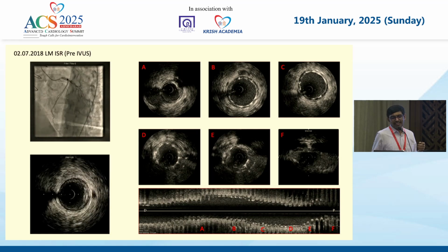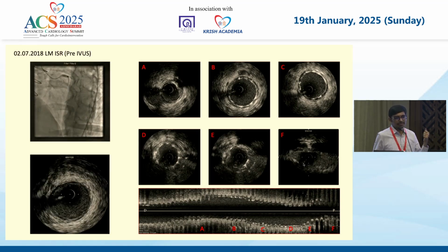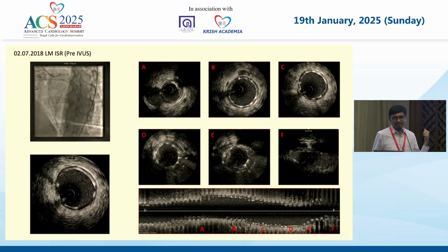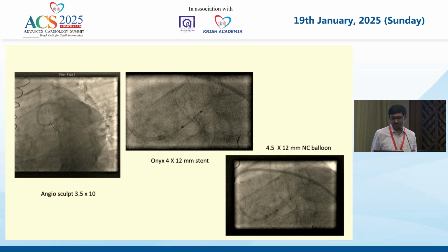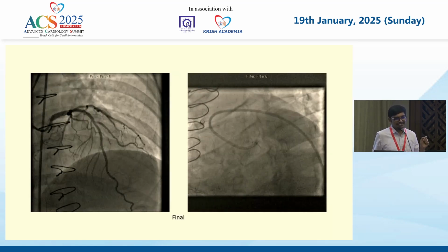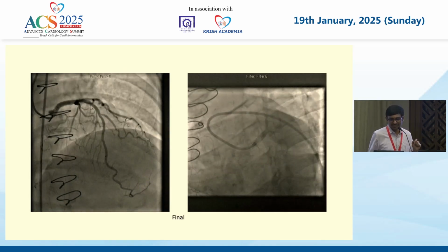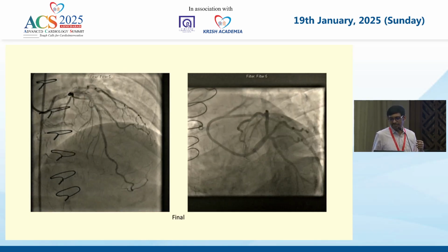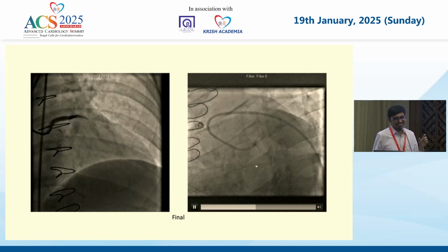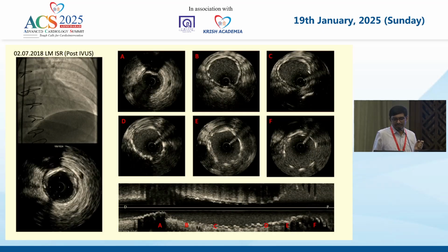And so the reason is longitudinal stent deformation because there's much crowding, most probably when the IVUS catheter was pulled back or your guiding was pulled back, that has deformed your stent. And so this time we went back and dilated. And fortunately, for the past 6 years, she's doing well. Still she's alive and doing well, and no further events. So simple things, correct? In the end, we made sure that the stent is there in the ostium. So again, this is what the final result is.